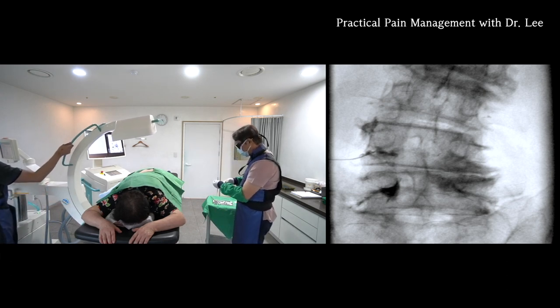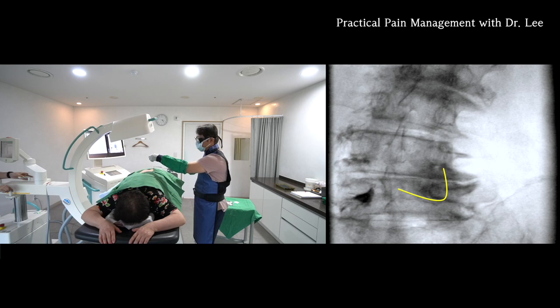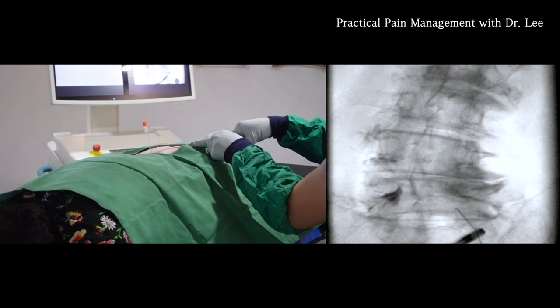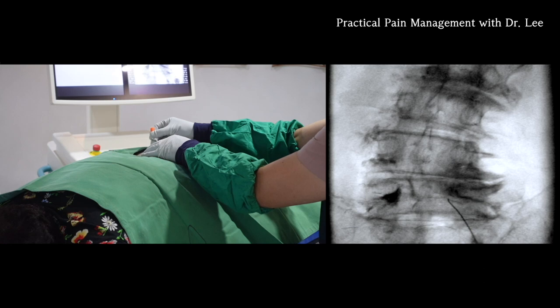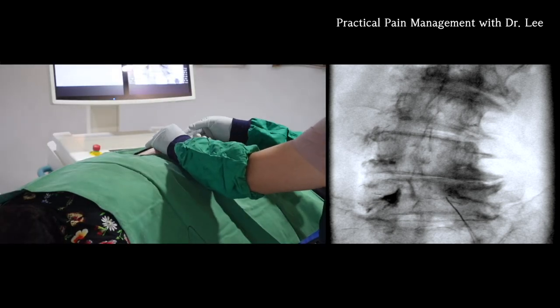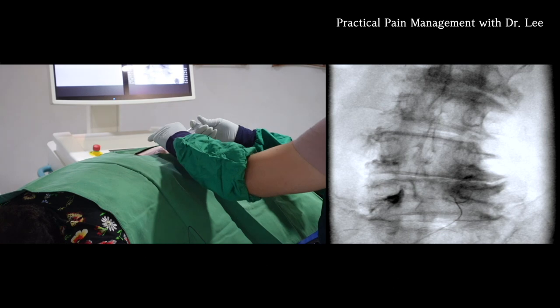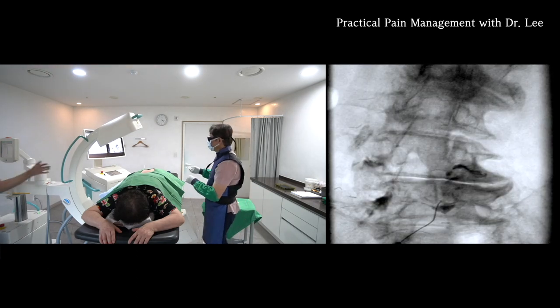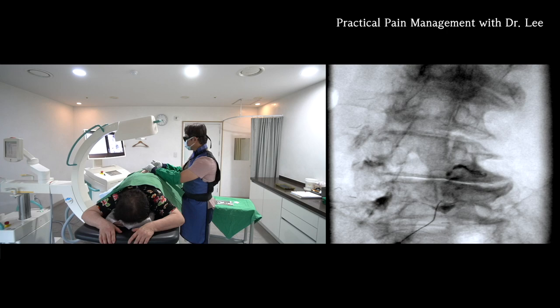Let's move on to the right L4-5 facet joint injection. Give me an ipsilateral oblique view. This is the imaginary line of the inferior recess of the facet joint. I'll check the needle location by the contrast spread. The contrast pattern looks good. I'll deliver the steroid mixture into the right L4-5 facet joint.